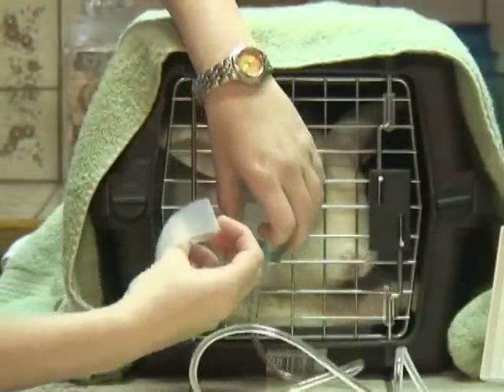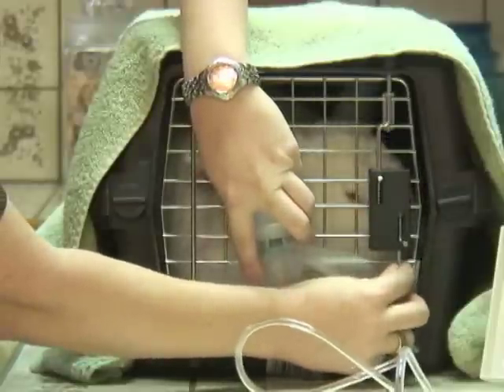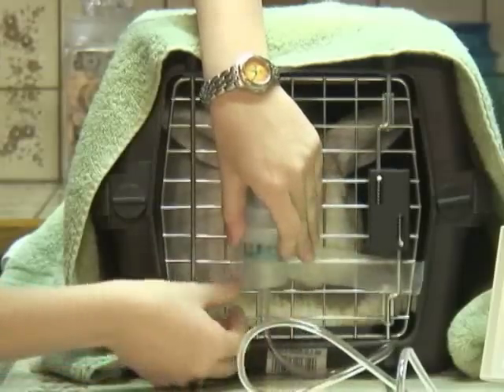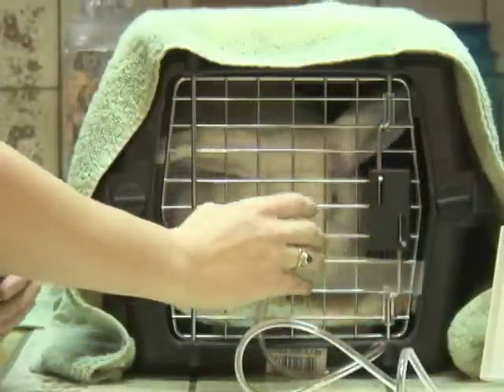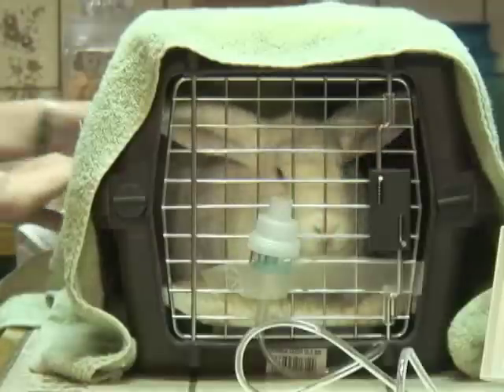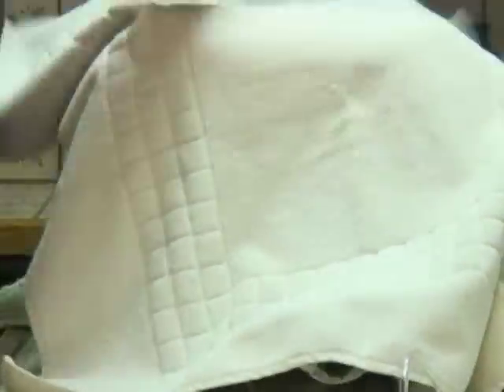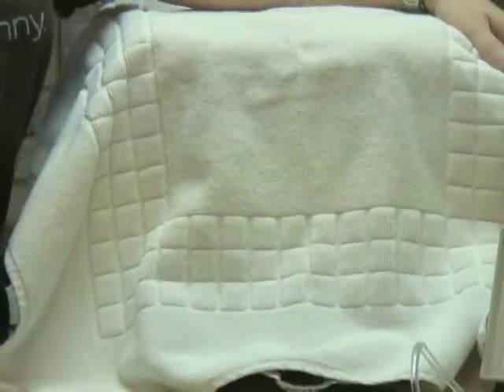Now that we have our tape cut, we're going to just adhere the medicine cup to the front — just something like that so it kind of sticks. And we're going to seal off the front with the cup in front, just like this, and start the nebulizing.